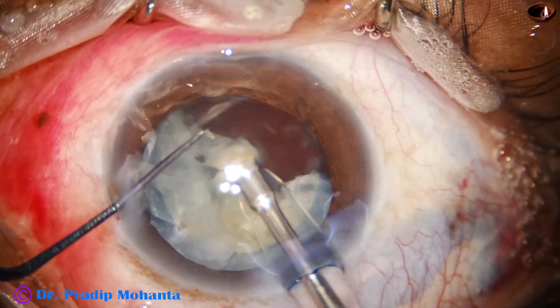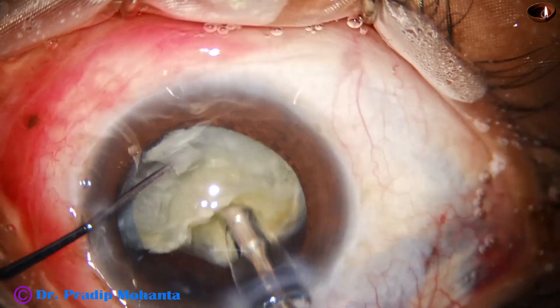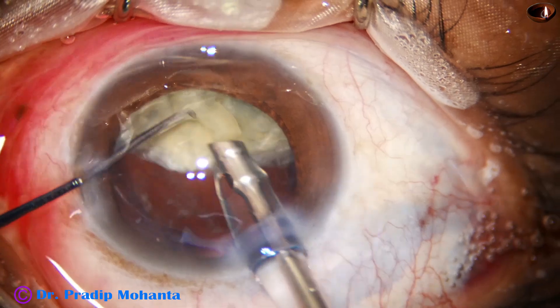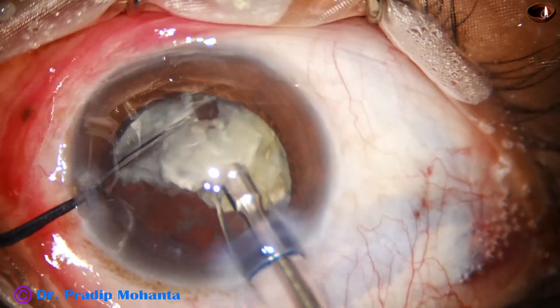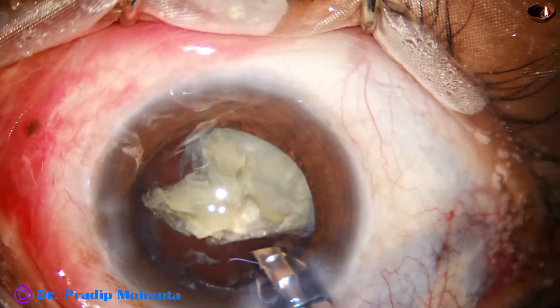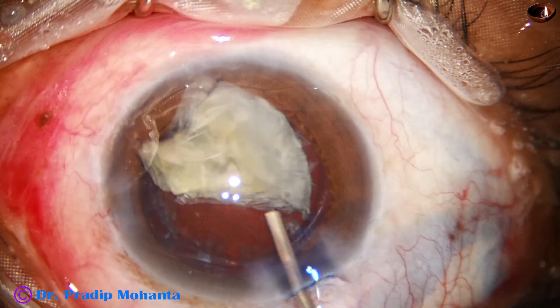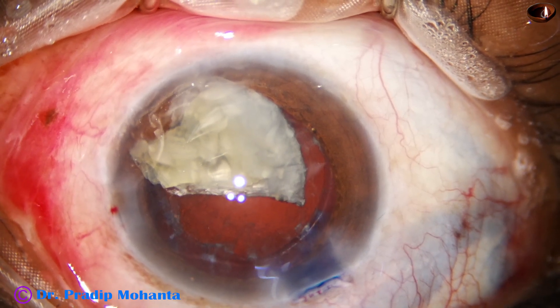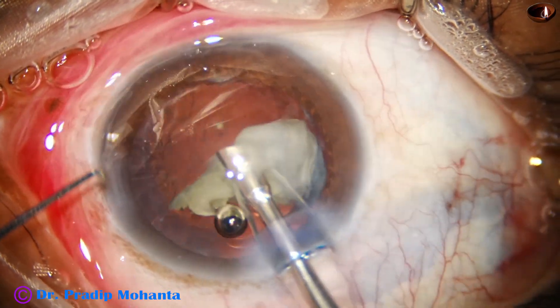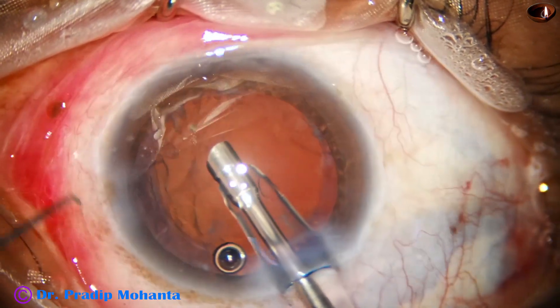So the emulsification is being carried out — emulsification of the pieces. The larger heminucleus is removed. For the other heminucleus, it is held nicely before you chop. Remember that you have to hold the nuclear piece very firmly, and then you attempt chopping. If the hold is not good, don't try chopping. Before you emulsify the last piece, use some visco to push the posterior capsule down — 2% HPMC in this case. Then the last piece is emulsified single-handedly because the posterior capsule then remains far behind.